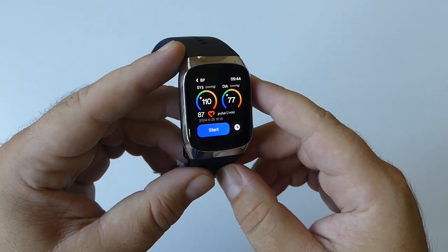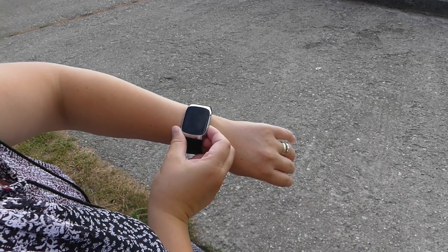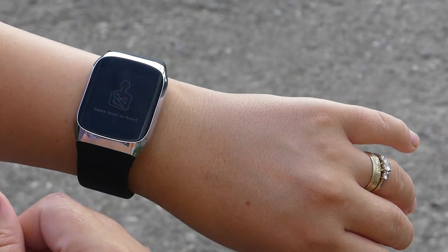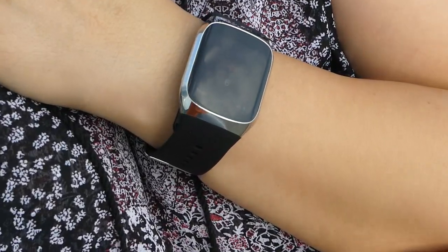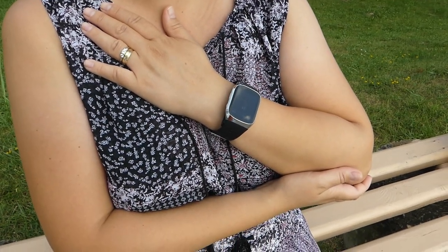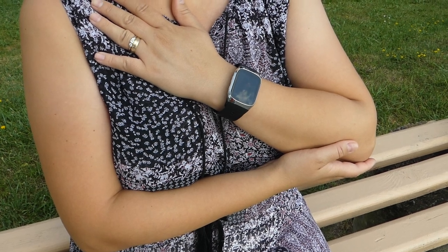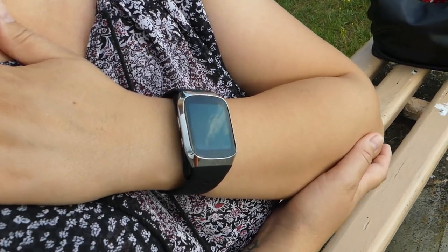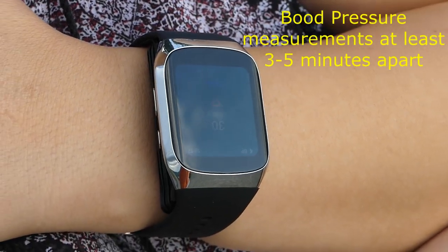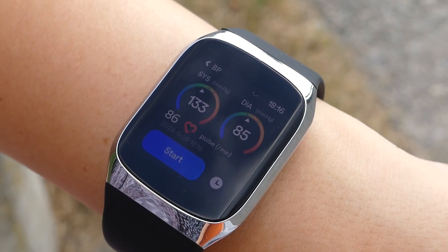On the main screen you have access to systolic and diastolic blood pressure, pulse, date, and time. Before measuring, wear the smartwatch correctly, do not compress the air cuff, and make sure the strap is two fingers away from the wrist bone. Take a deep breath, keep your body relaxed and still. For correct sitting posture, the watch should be at the same height as your heart, and take two measurements at least three to five minutes apart.